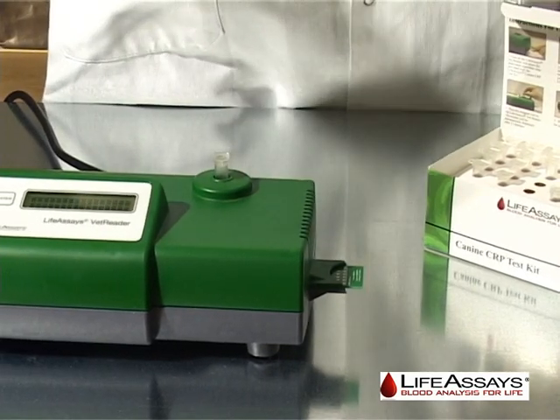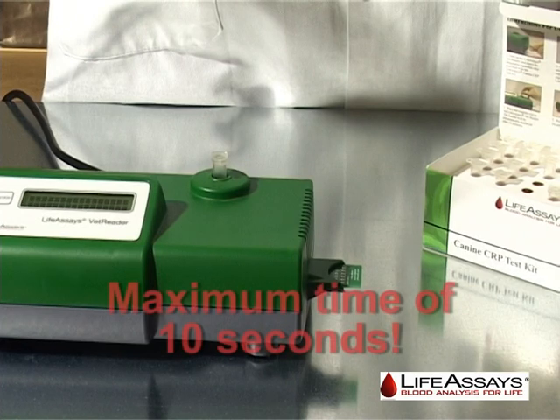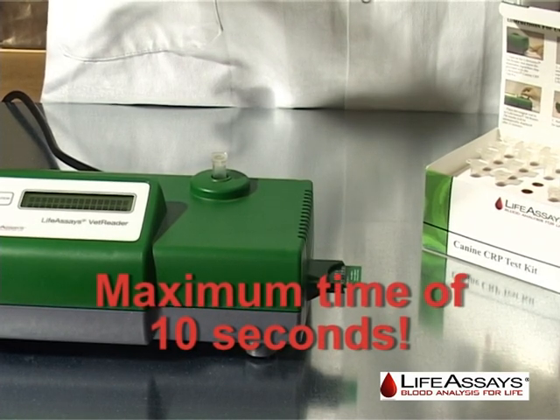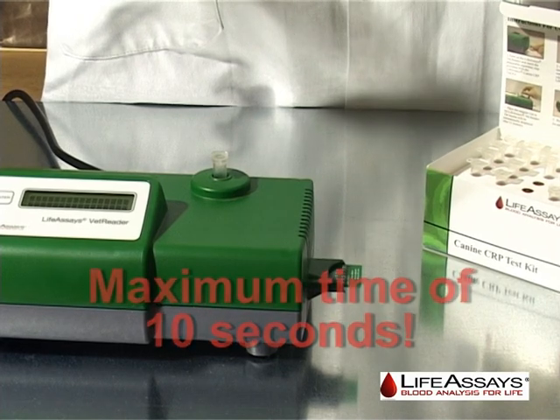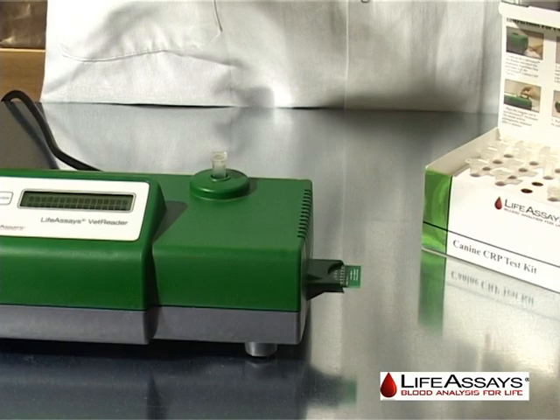Load the reagent vial back into the VetReader. Please note that the reagent vial must be loaded back within these 10 seconds. If not, the measurement is aborted and the reagent chip will count down one measurement, and the user loses one test.